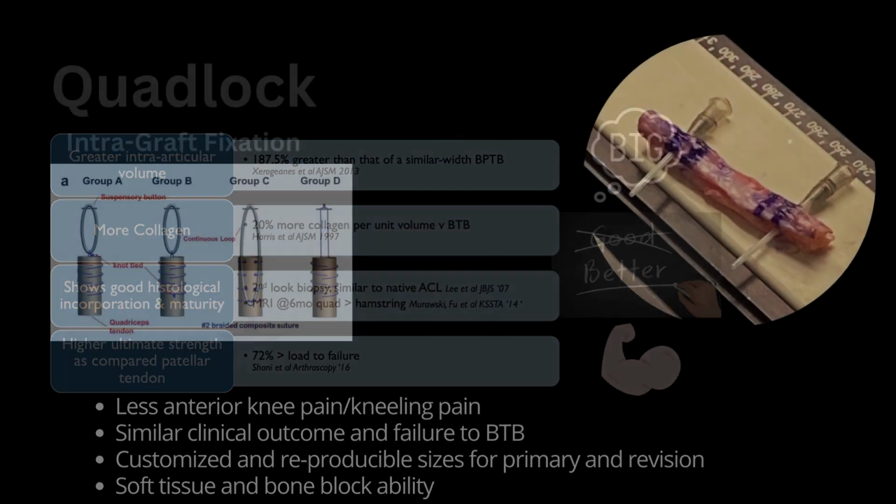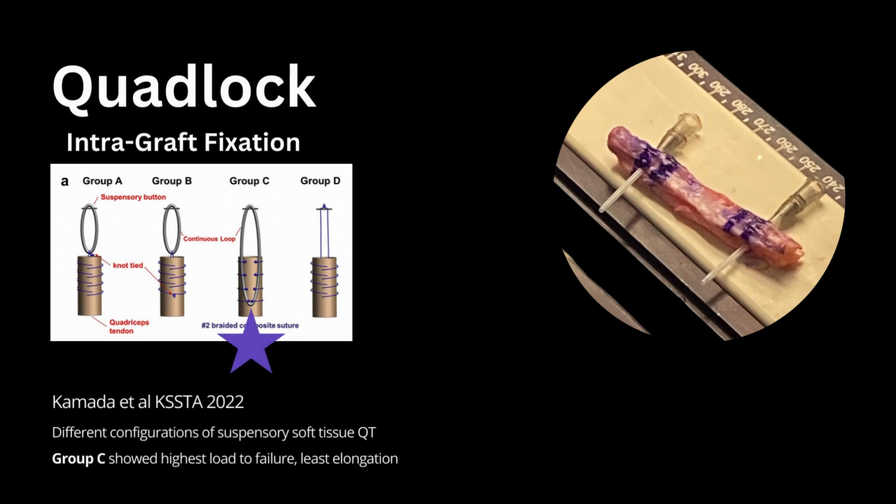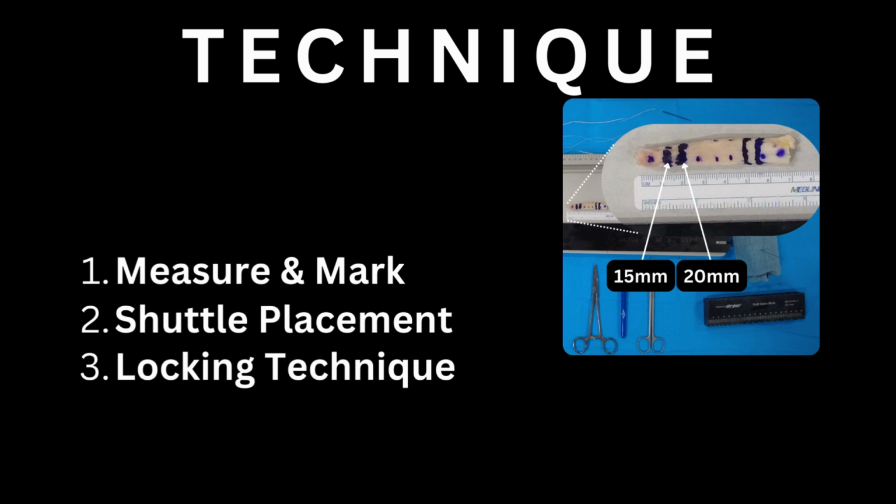And I think it's been a challenge trying to understand how to connect a suspensory device to this tissue. And there was a great study in 2022 biomechanically looking at this, where they showed that potentially the best way is to connect it directly to the graft itself. And what we're going to show is how to both connect this into the graft with an intra-graft fixation, as well as have a suspensory locking technique around this.